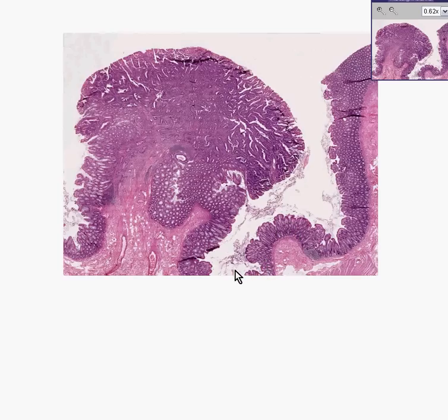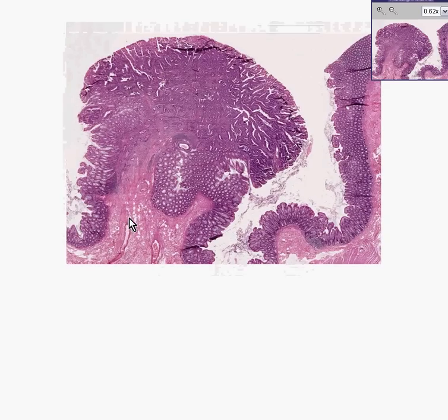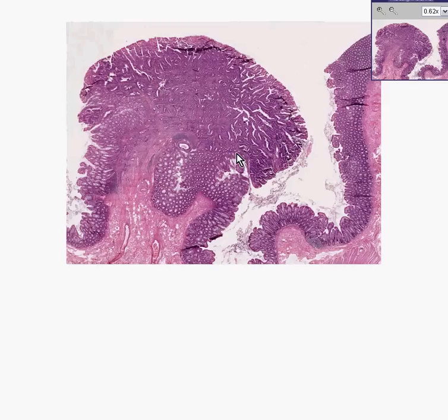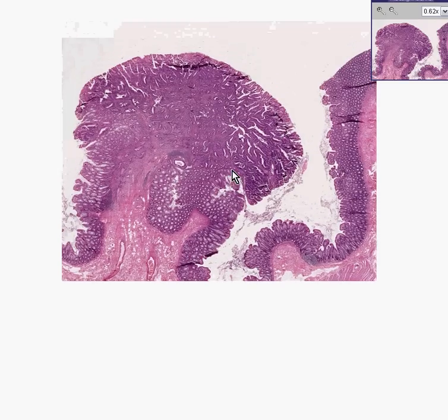Notice we still have normal mucosa here, but in this area the mucosa, as well as in the mucosa here, appears to be overlying a projection of submucosa which is overgrown by polyp.